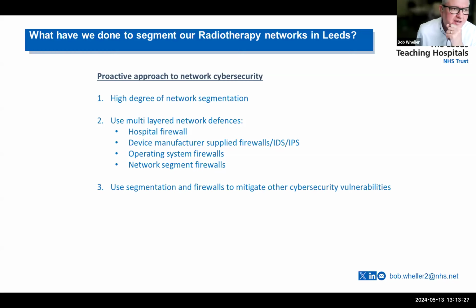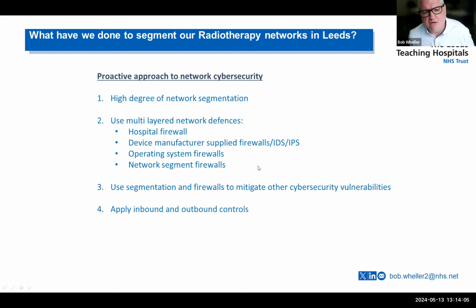So Patrick mentioned the fact that we can't always patch our medical devices. In fact, most of our radiotherapy devices we can't patch, and we can't run antivirus, or certainly on most systems we can't run it. On some systems we can run it, but not with real-time scanning, and sometimes we can't update the signature files of the antivirus. So we've got other cybersecurity vulnerabilities, and what we do is we use our firewalls to mitigate those vulnerabilities. And we apply both inbound and outbound controls on our firewalls.